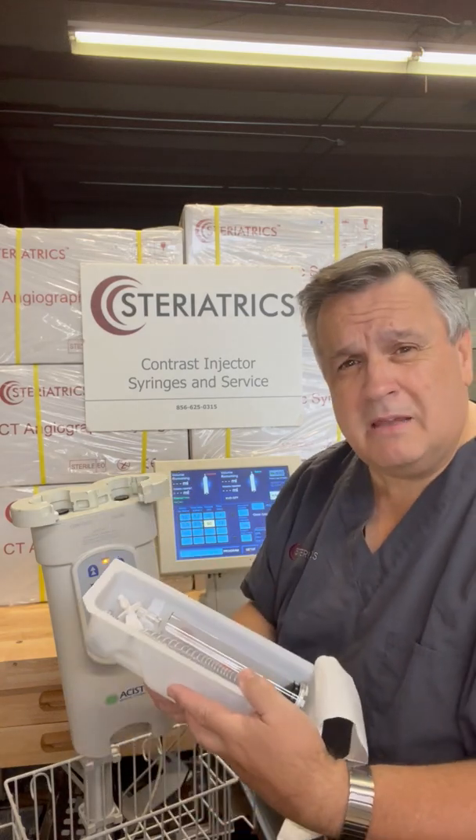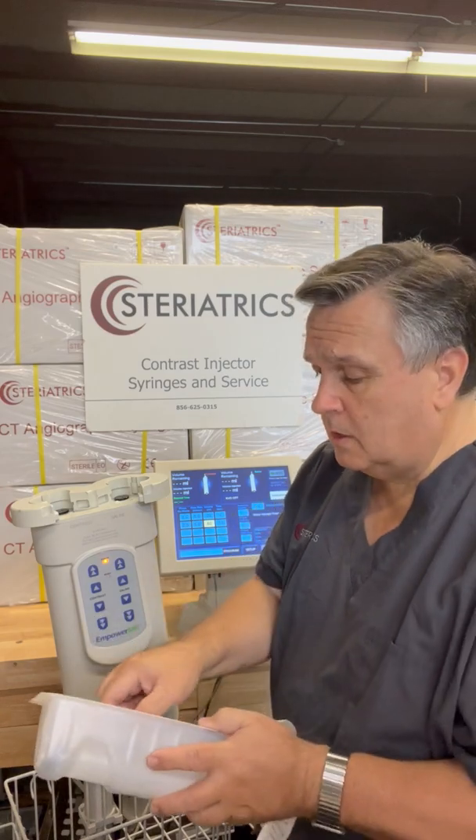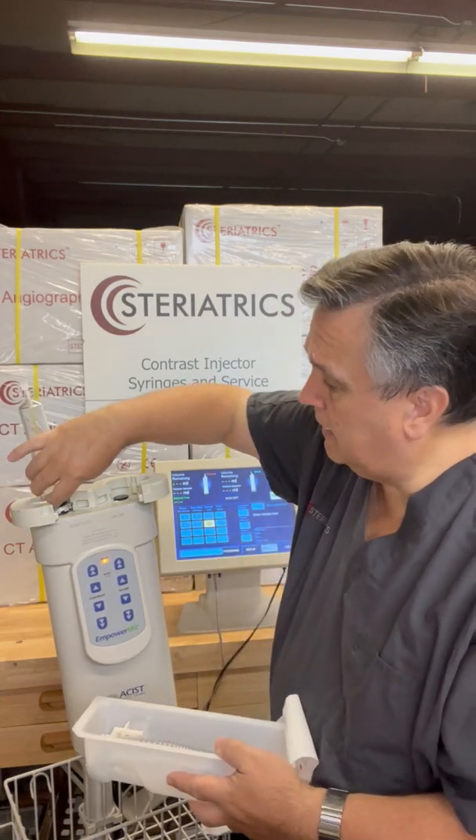Let me show you how to load them up. The key thing is I'm also going to show you how to unload this injector — it's a little different from the rest. So the first thing we're going to do is get our syringes out of the kit.